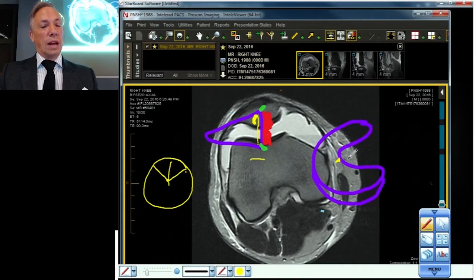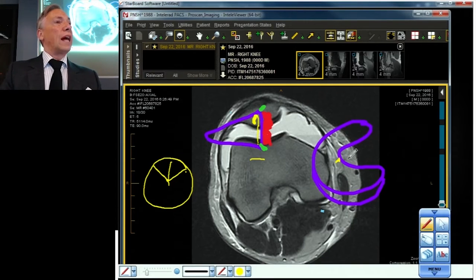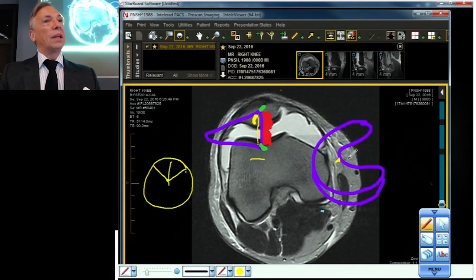addressed. Now, in the orthopedic literature, they say that if the tear has a depth of greater than 6 to 8 millimeters, those are more likely to become unstable, to propagate, and even to lead to consequences like fragmentation, locking, and chondromalacia. But I think we've gotten a little more liberal as time has gone on and less aggressive in trying to resect these tears because there's no sewing them. You just go in with a claw and you just claw them out of there, which is kind of ugly.